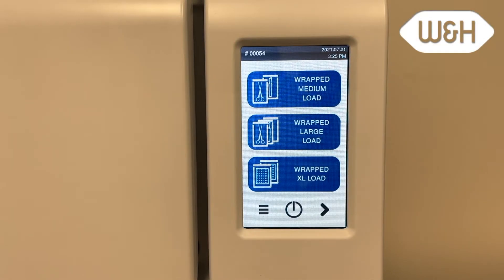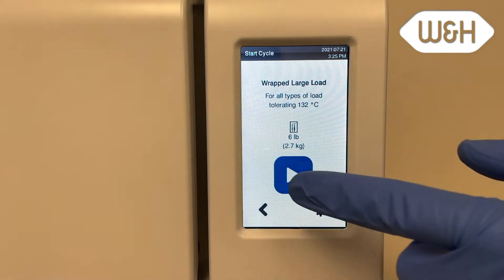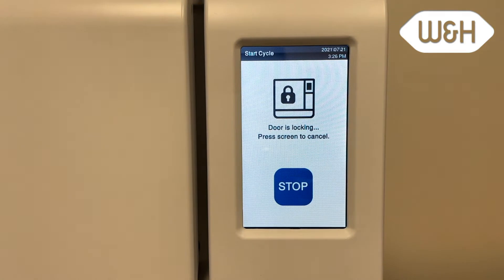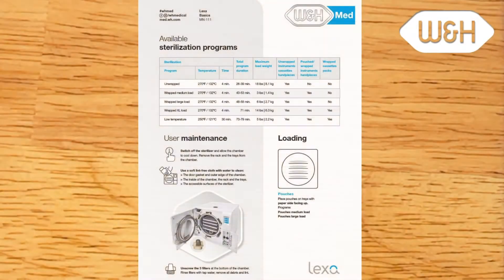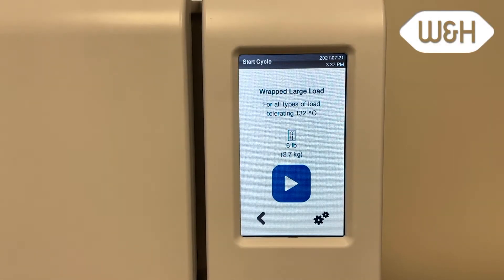To initiate a sterilization cycle of the Lexa, close the front door and select the desired cycle. If the user has any questions on which cycle to choose, they can refer to the cycle card that comes with the Lexa. Press the start icon to initiate the auto door locking and cycle execution. After pressing the start icon, the door locks automatically and the cycle starts.